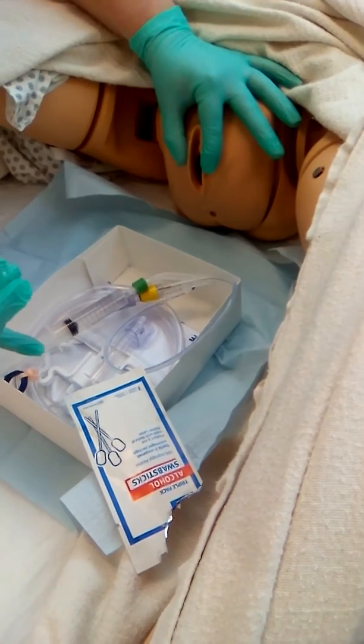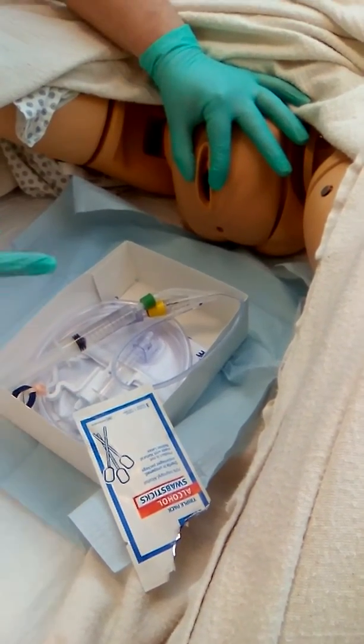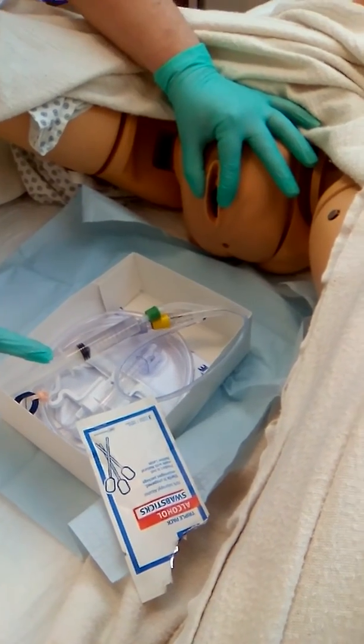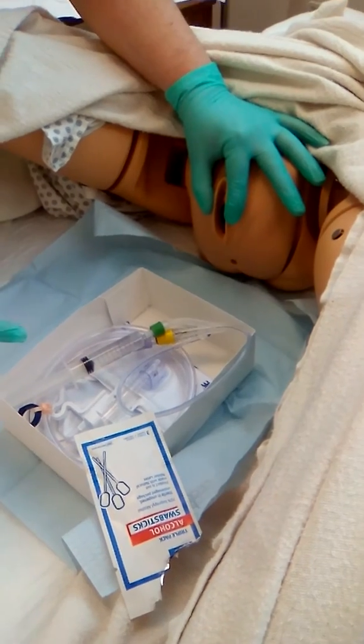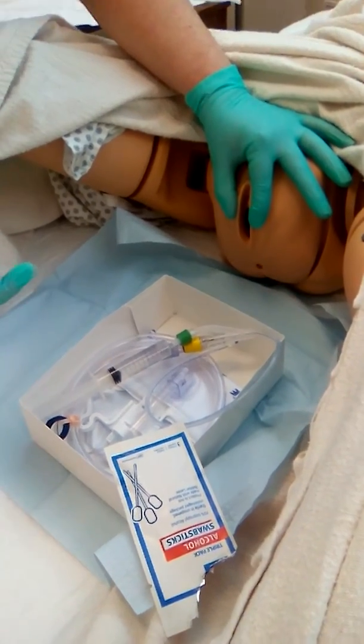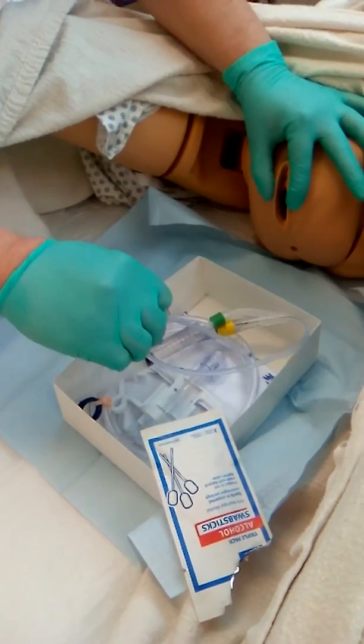I would consider this contaminated because it fell out and touched my 1-inch border. At this time, I would get a different kit. I am going to pick up the catheter and insert it.